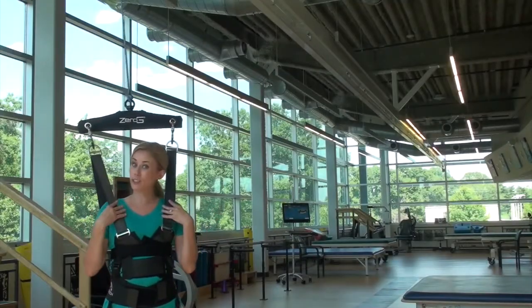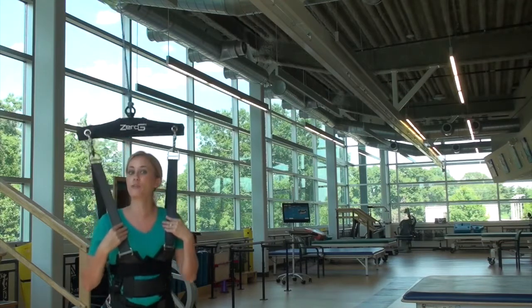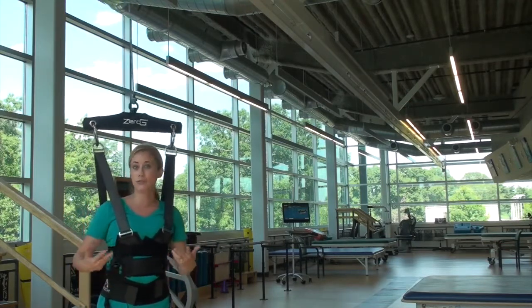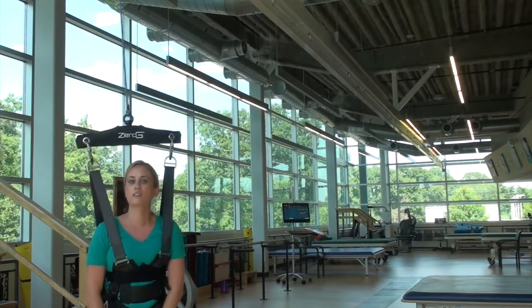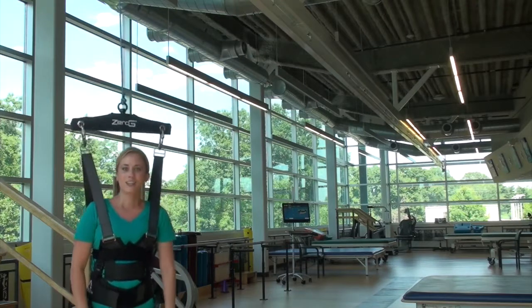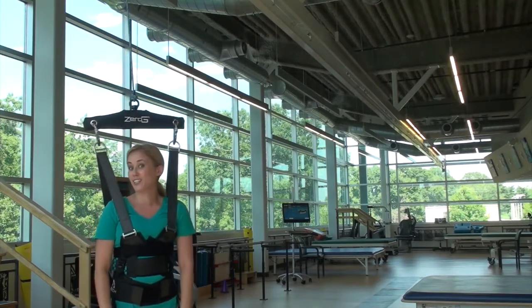Now I've got my harness on. I'm in Zero-G and it's provided me dynamic body weight support, which allows me to move up and down. I'm actually right now only 10 pounds offloaded, so it's not too extreme, but it is making me feel just a little bit lighter. Now we're going to show you some other features and things that it can do.